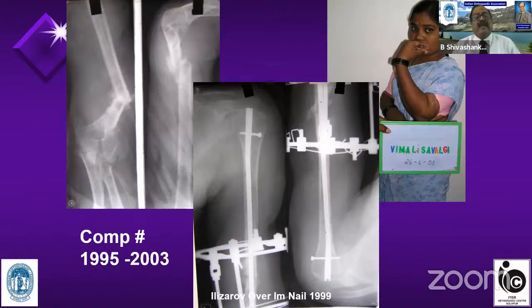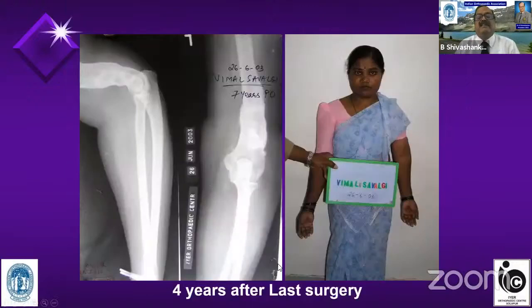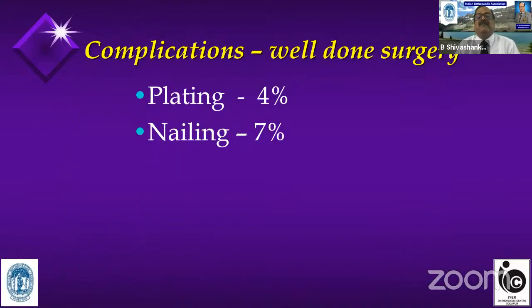So this was a case of non-union. Already 3 times operated by so many other surgeons. I was invited to operate this patient. I did a nailing. Again, you can see I used an Ilizarov frame above and below to compress the fracture. The fracture, which had not healed for almost 4 years, united after this surgery of mine.